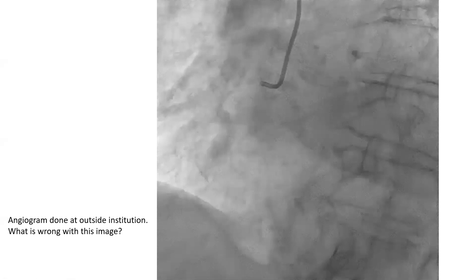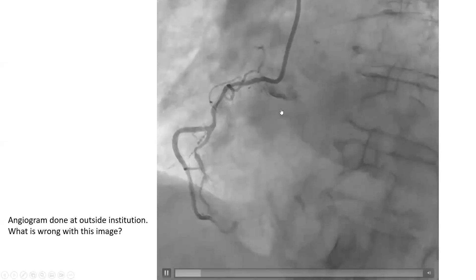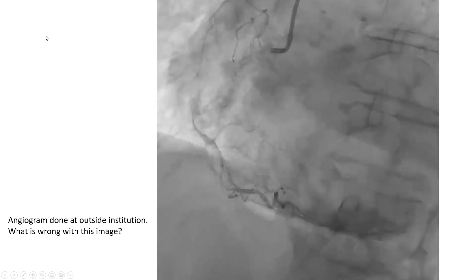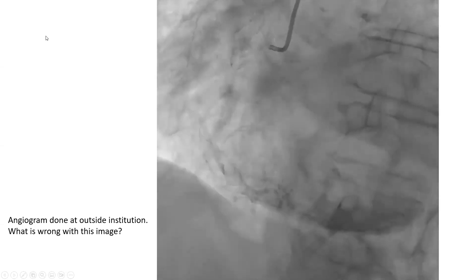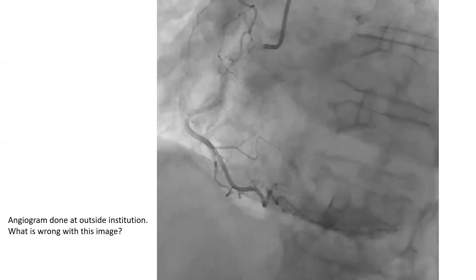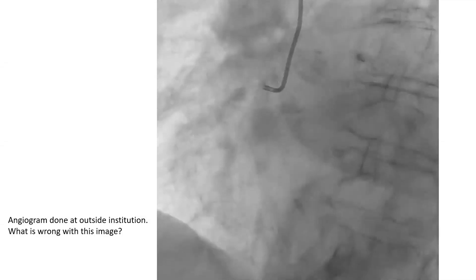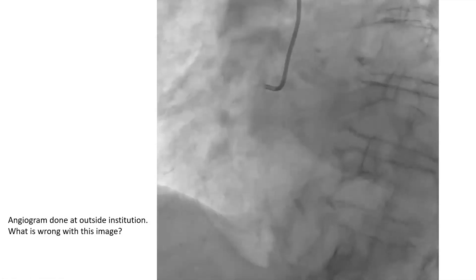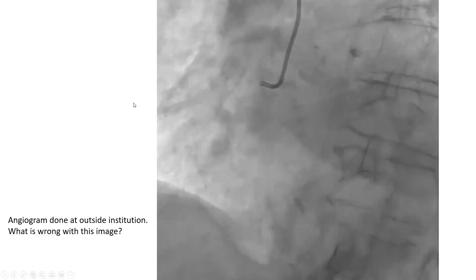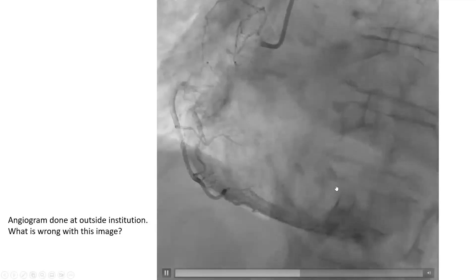This is an angiogram done at an outside institution. Look at it and tell me what's wrong. Can someone tell me what's the immediate next step? What's the diagnosis and what's the next step?